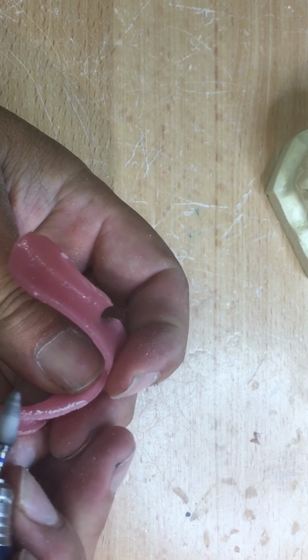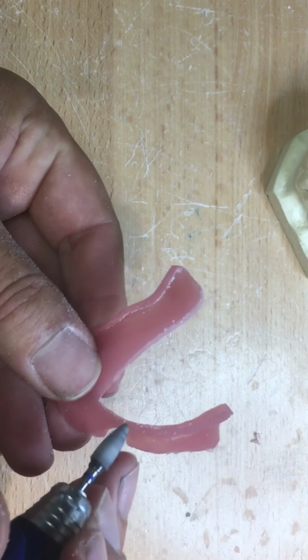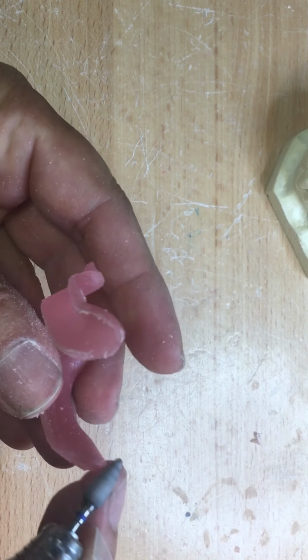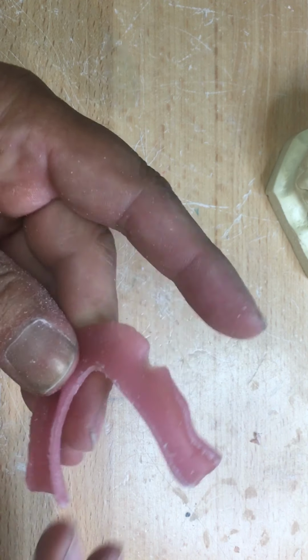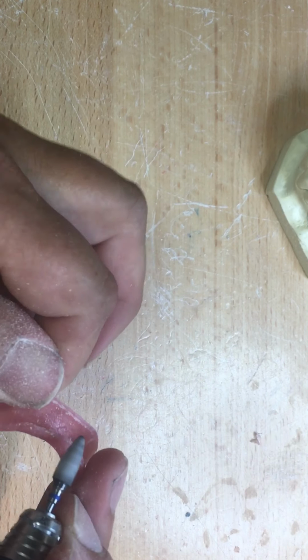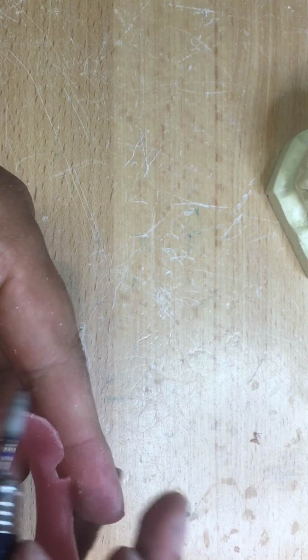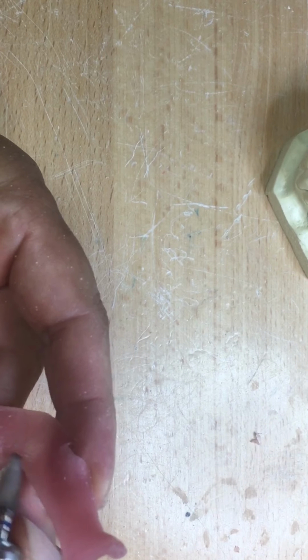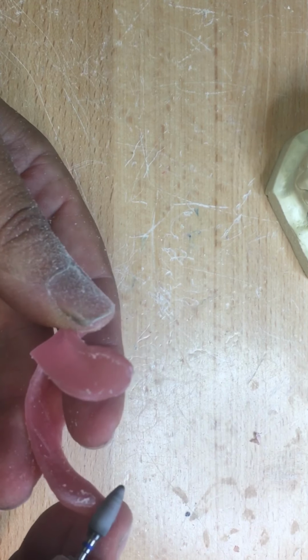Now I took my time, generally pretty good there, trimming the extensions, no lingual frenum interference, nice and smooth all the way around, no sharp edges. If you look at the rubrics I've given you for this in the occlusion rim, follow each step. Number 1, base of the model. 2, extensions, smooth borders, major connector extensions above the height of contour in the posterior, above the cingulum in the anterior, appropriate thickness, no thin spots.